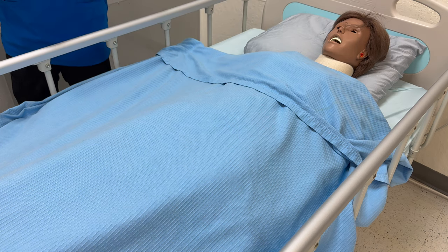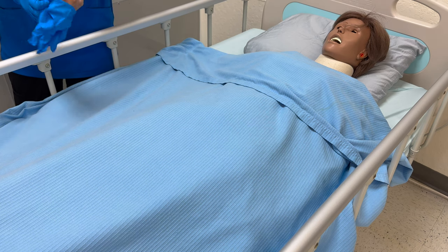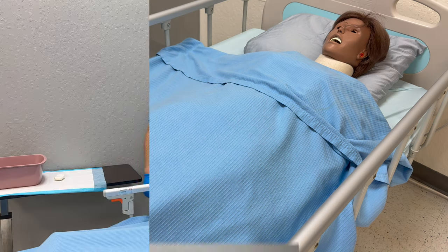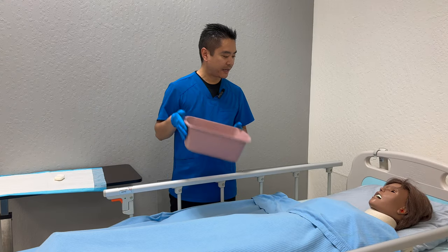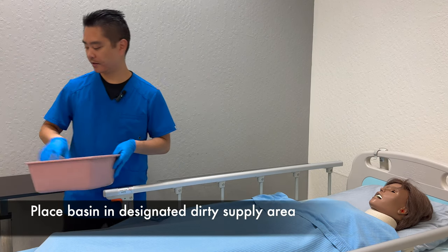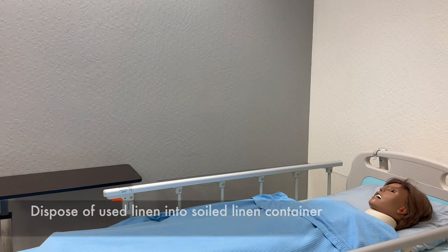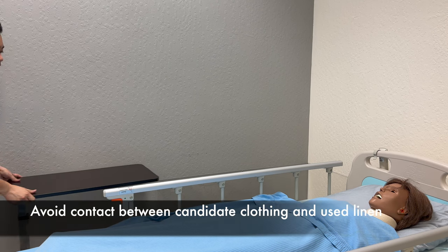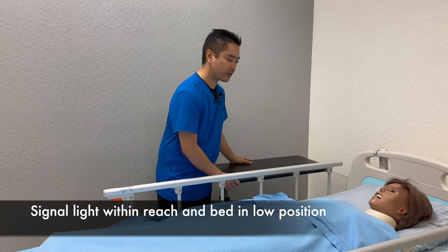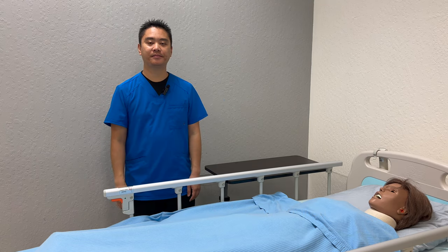I'll be right back, I'm just going to clean up my supplies. We'll put on our second set of gloves to clean up. I'm just going to empty, rinse, and dry the basin. Here is your call light, your phone, tissue, water, and magazines. If there's anything else you need, let me know and I'll be back. I'm going to open curtains, wash hands, step outside, and record and report.